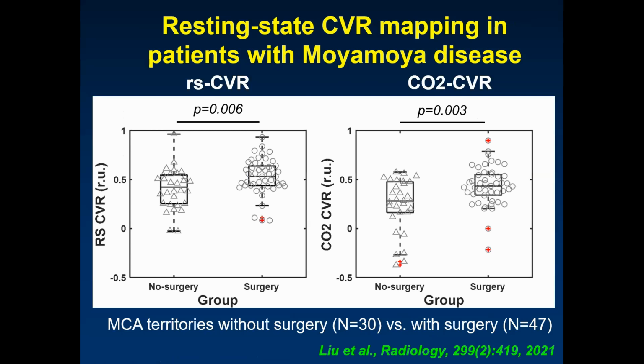We also tested the sensitivity of the relative CVR values obtained from this resting state scan. We compared the MCA territories in patients before and after the revascularization surgery.